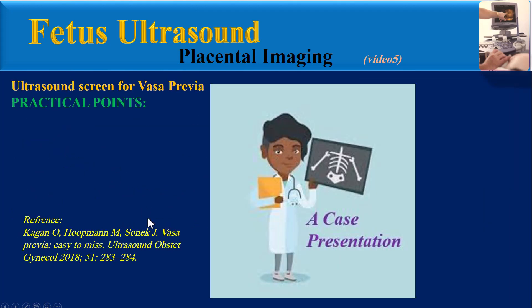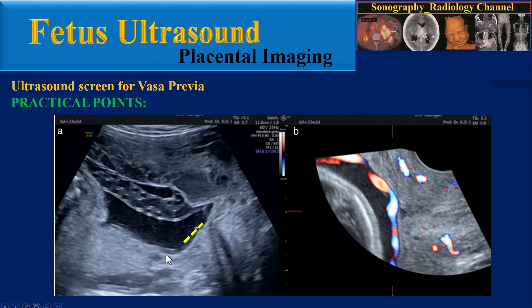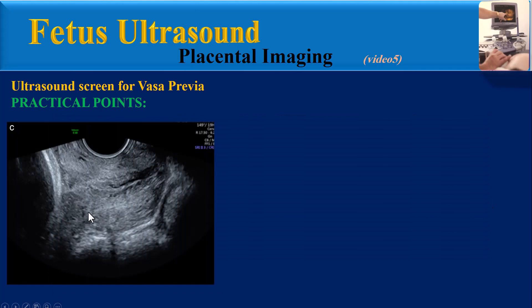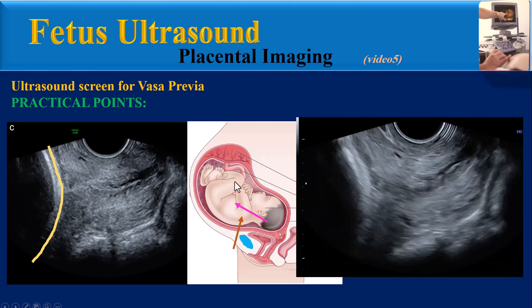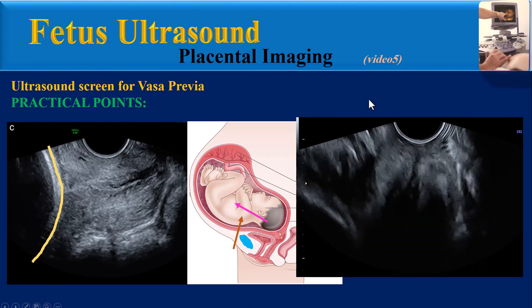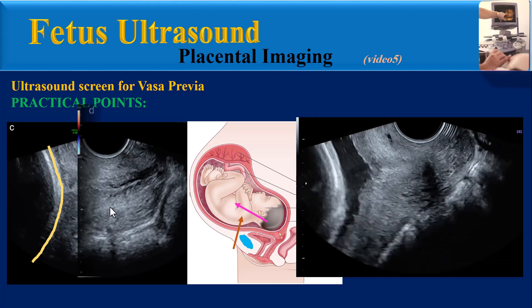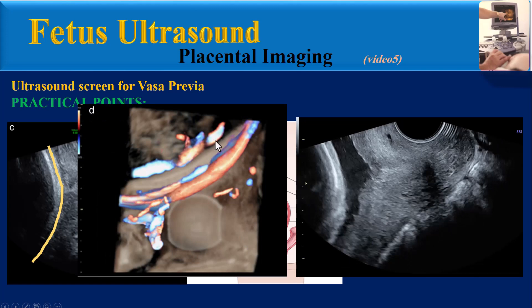Here we can review a teaching case together. This image shows a low-lying placenta with marginal placental cord insertion and a fetal vessel extending from the cord insertion to the accessory placental lobe over the internal cervical os. At 31 weeks gestation, the fetal head is applied firmly to the lower uterine segment, preventing visualization of the aberrant vessel. By performing the displacement maneuver, the fetal head is moved upward and the vessels and Vasa Previa are clearly identified on color Doppler.